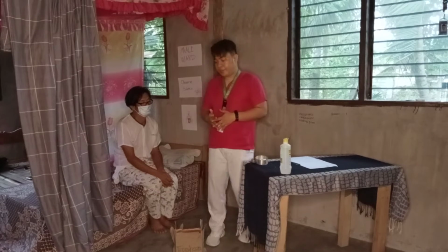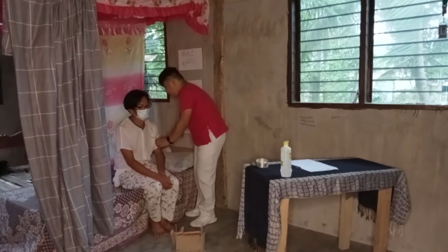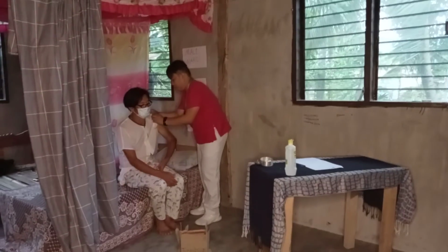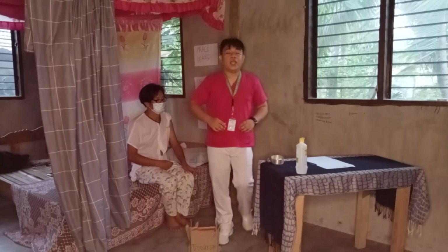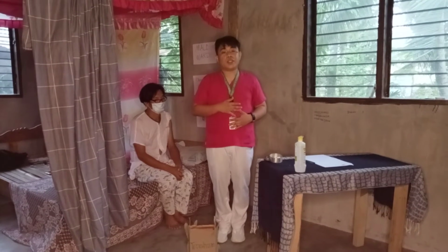Two, placement. Insert the thermometer and leave in place for the required amount of time. Place the arm across the chest, usually two to three minutes. Some digital thermometers give a short beep when the reading is done. Rationale: to provide enough time for recording the temperature.